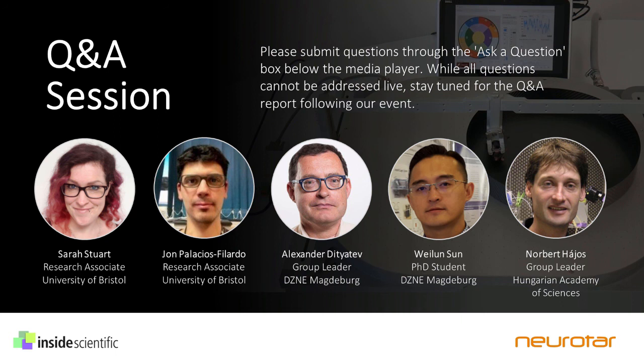So after insertion of a silicon probe, we usually wait about 30 minutes, but often an hour. We have found that the stability of the units upon acute insertion of a silicon probe is usually tens of minutes, so at least half an hour. For that long, we can really record stable units. But if we are losing units, we can move slowly deeper and search for new units and record a distinct neuronal population activity.